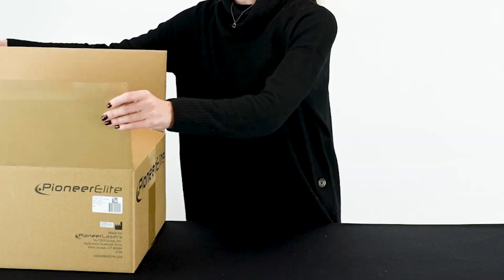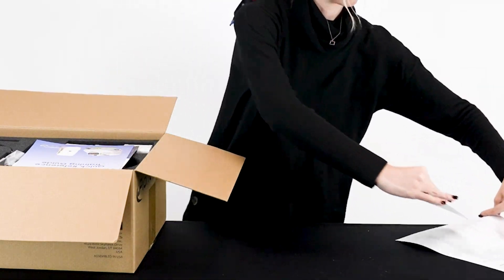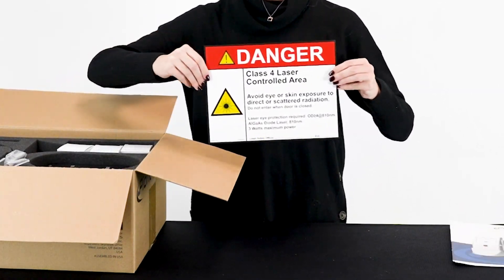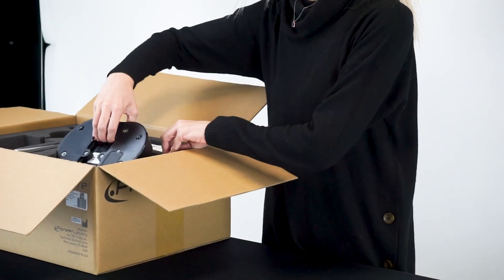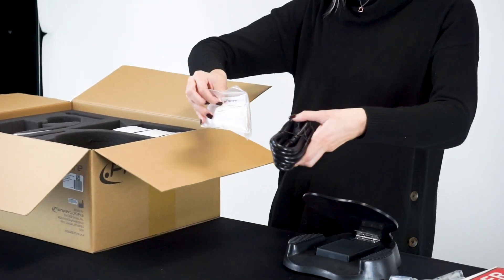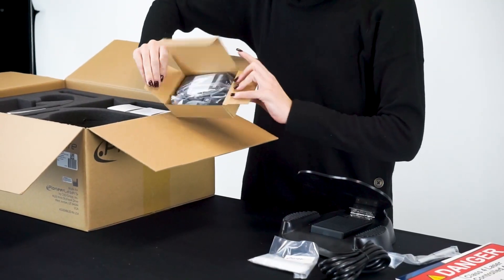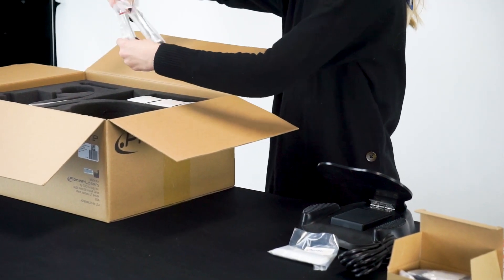Your CAO Pioneer Elite diode laser comes with one owner's manual, one quick start guide, one procedure guide, one laser safety sign, one foot pedal, one power cord, one pack of handpiece barrier sleeves, one power supply, and one therapy handpiece.